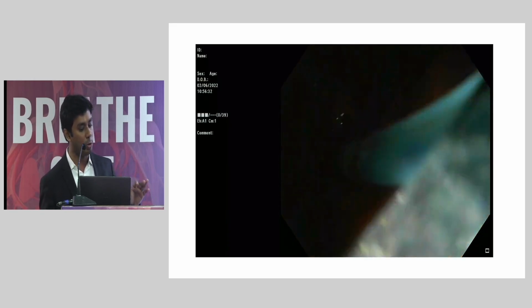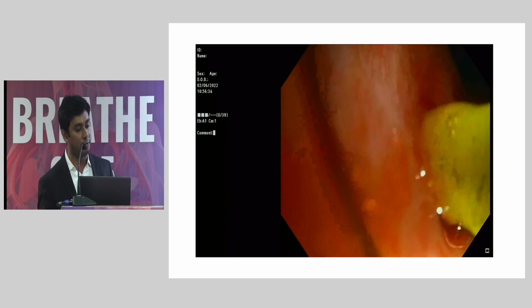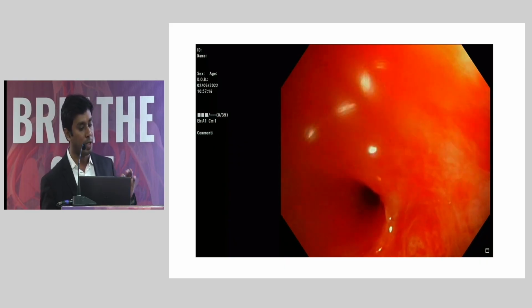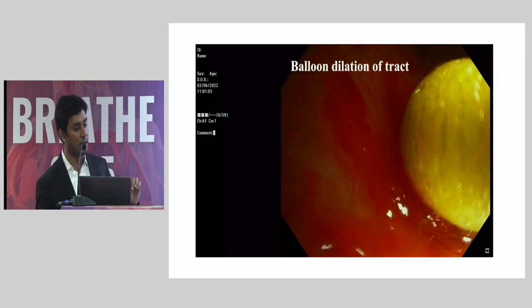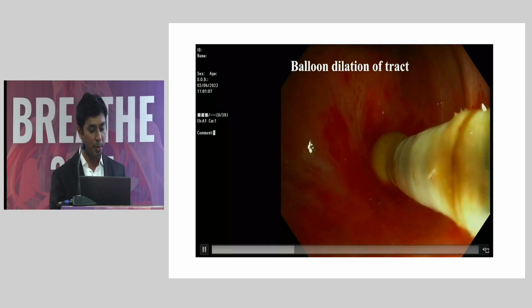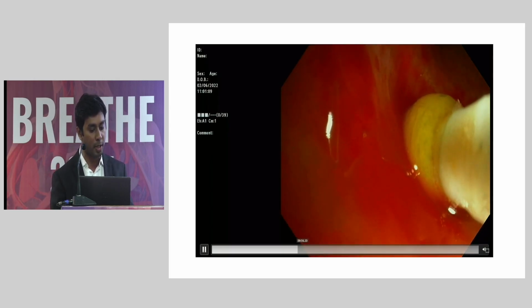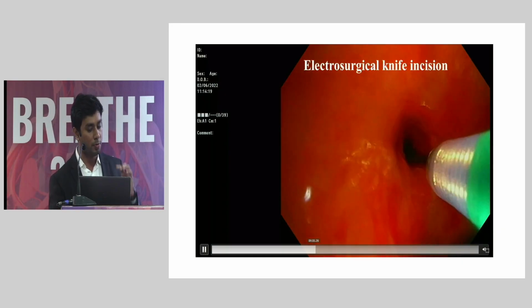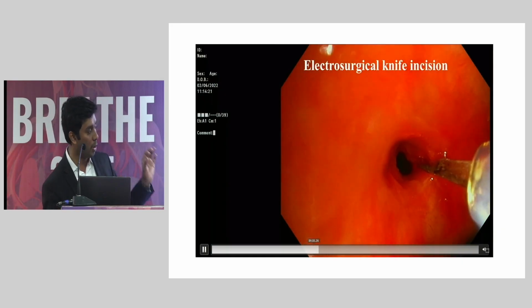So what we are doing initially is the blunt dissection of the airway. So we use these Fogarty balloons to cause the blunt dissection of the airway. And luckily we were in the right tract and we were able to open up the airway. And once this airway is open, right now you are seeing that we are using the balloon to further expand the airway. And once it is done, we are able to define the path, but the hole is quite small.